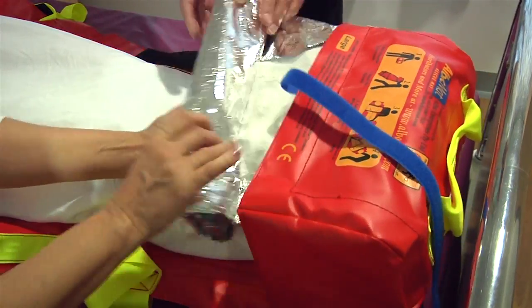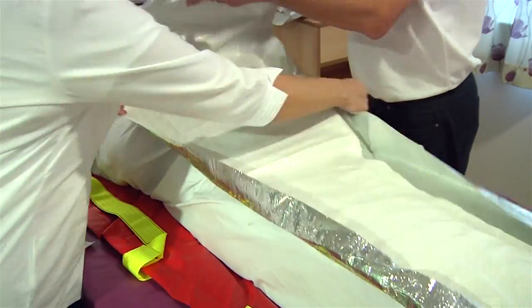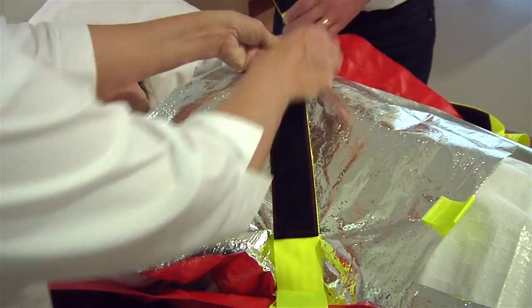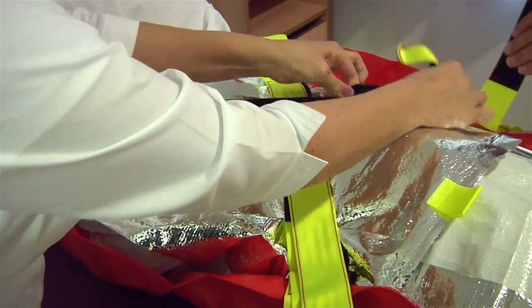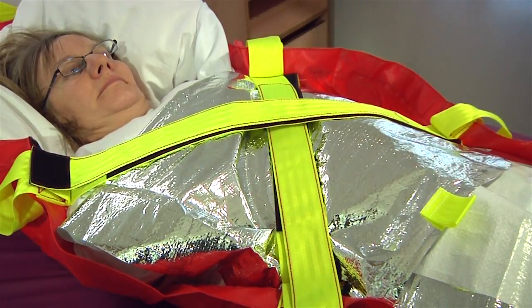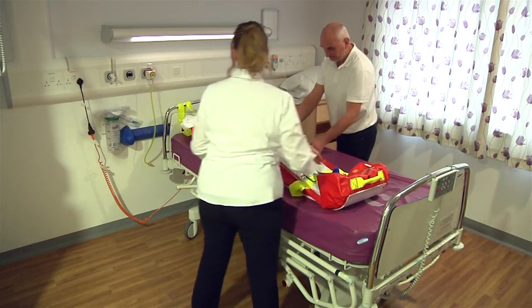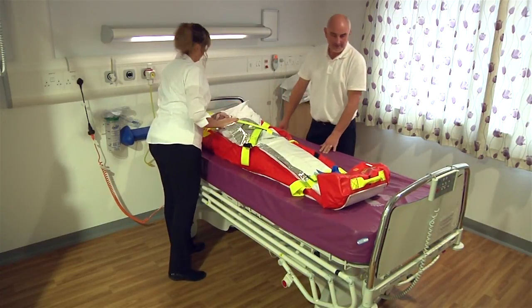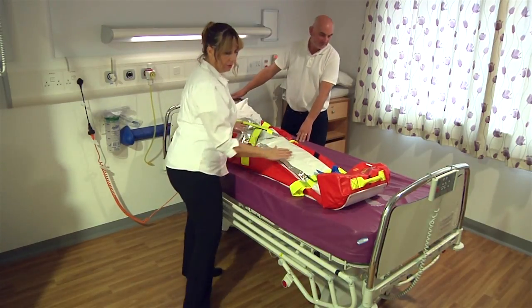Cover the patient with the foil blanket found in the foot pocket. This will add to her warmth and comfort, particularly if the designated evacuation area is well away from the building. Working in pairs, fasten the straps across the patient's chest and knees, ensuring they are tight but comfortable. Please consult your moving and handling department to ascertain the correct method of transfer for your own specific environment.